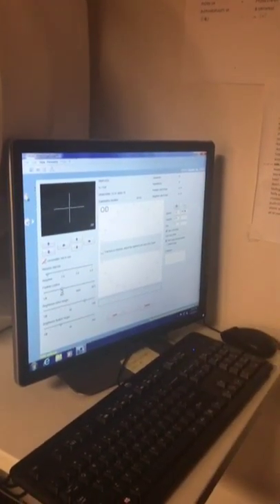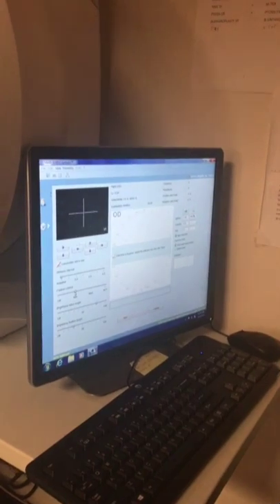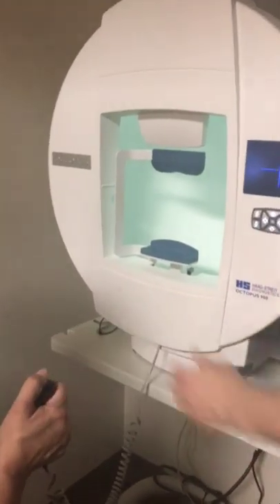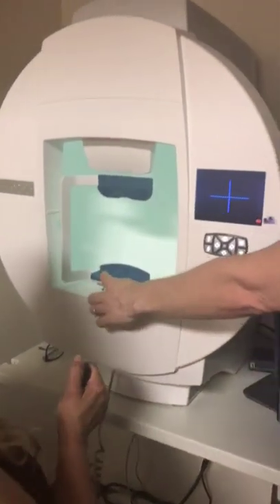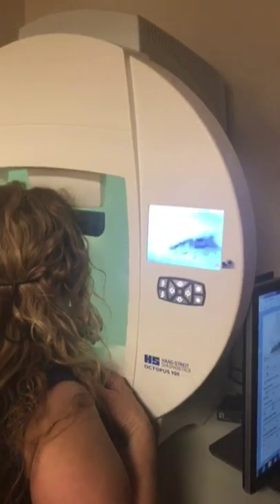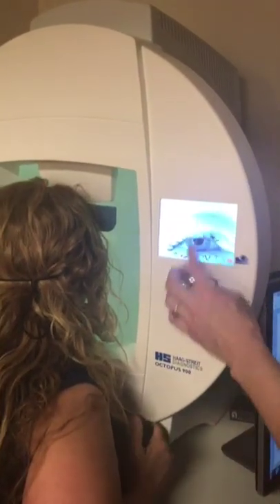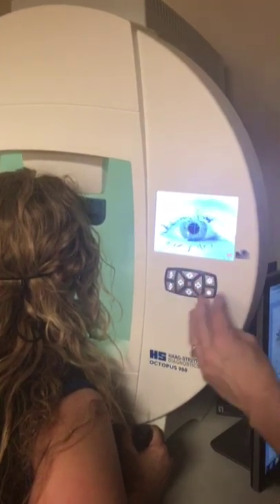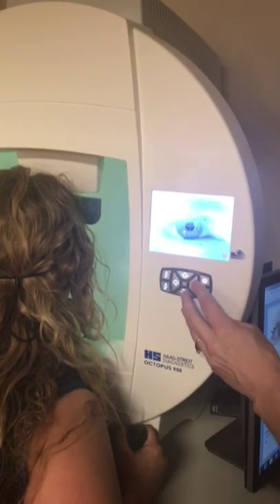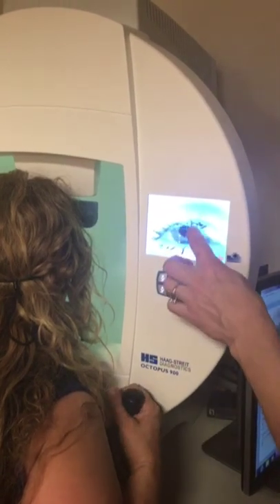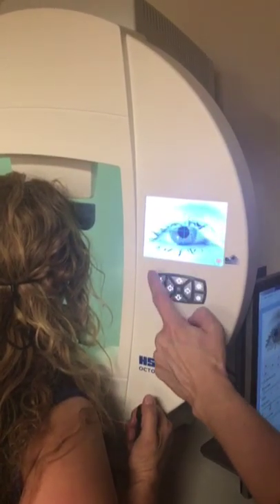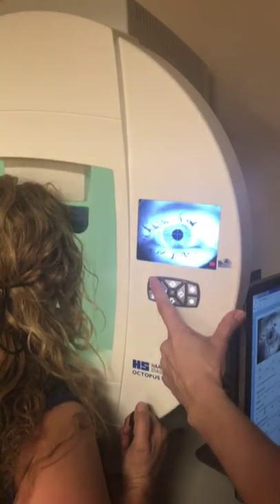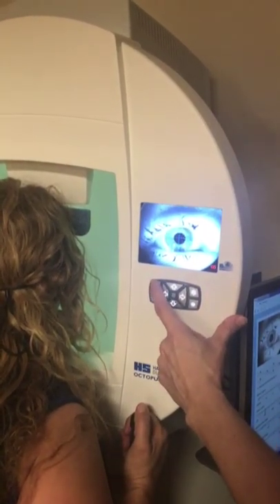And then you hand them the button. Alrighty ma'am, here's your button. At the top you're going to push it right on top and I'll show you how to use it. Let's get you scooted forward and put your chin on the left, forehead all the way forward. You can adjust your table height with a button and you can also adjust your patient with these buttons here. There's also coinciding buttons on your actual screen so you can do it from here or the computer monitor. Once you get her centered with the crosshair right in her pupil, you push this button to bring the lens up as close as you can get it to them. Ma'am, does that look better with the lens? Yes.